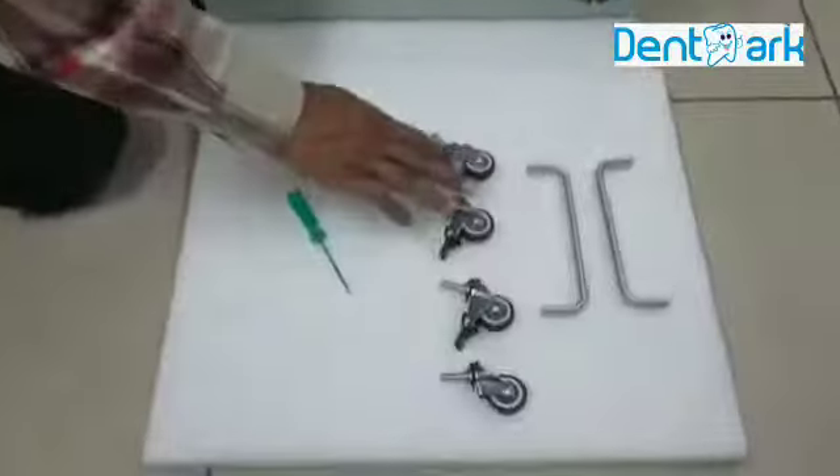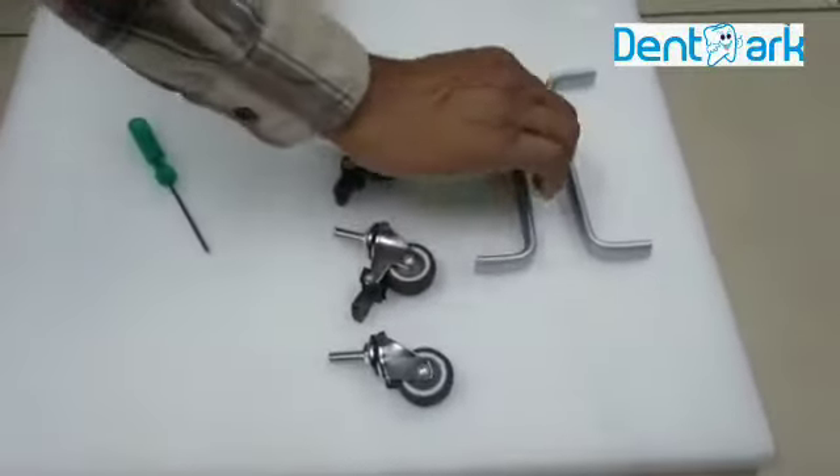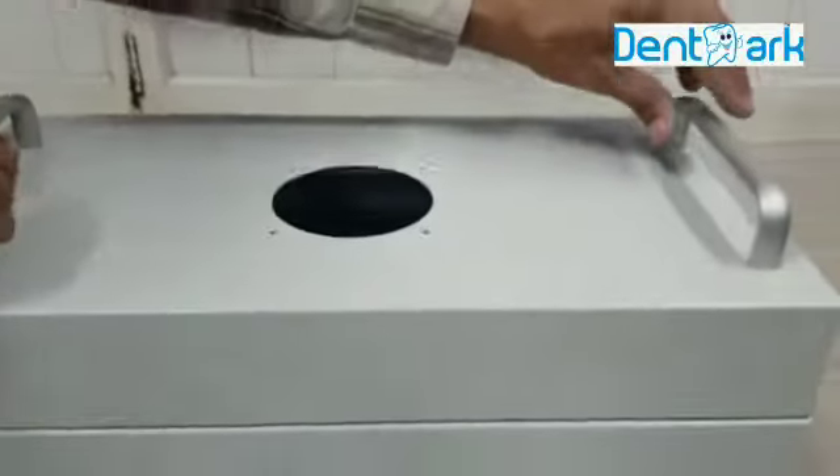These are the four wheels and two handles. This handle can be fixed over here. It comes with screws also. I will tell you how to fix the handle.